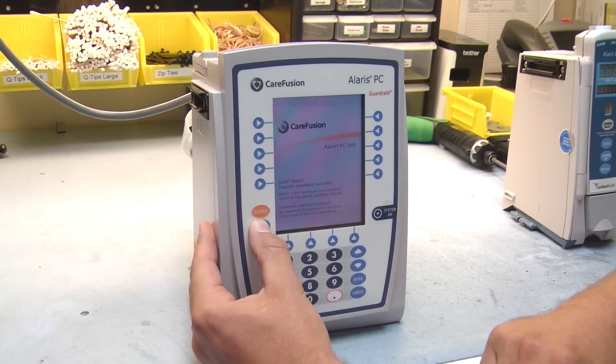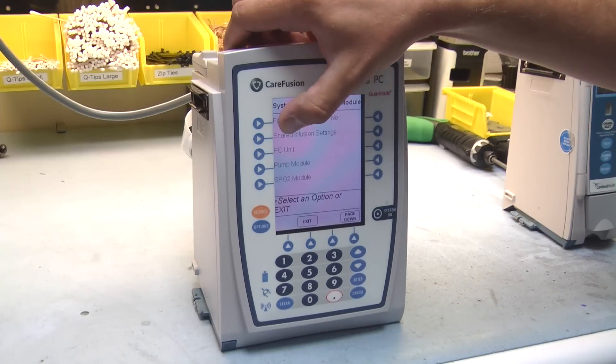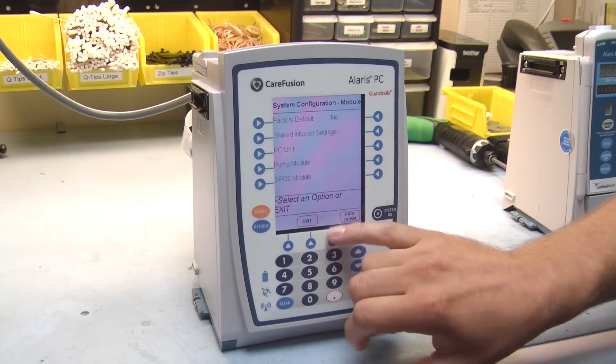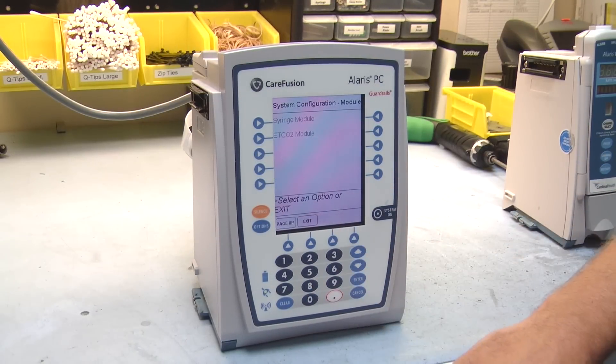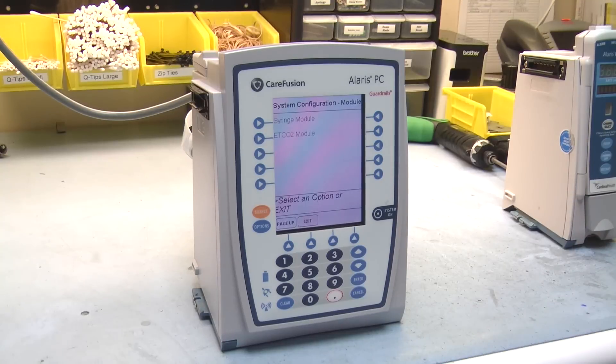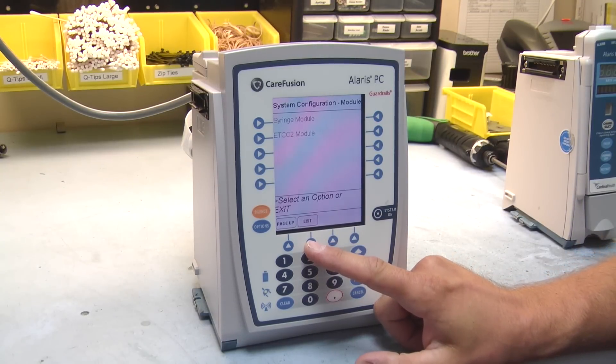In this menu, you'll be able to change your clinical settings for your patient care. We have our shared infusion settings where you can change those for the PC unit, pump module, and SPO2 module. If we page down, you'll see you can go into your syringe module and the ETCO2 module. In each one of those menus, you'll be able to change certain settings to treat your patients just right.